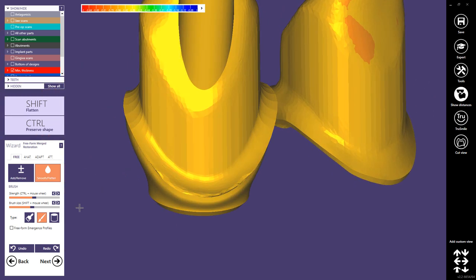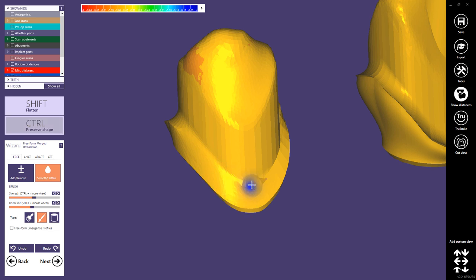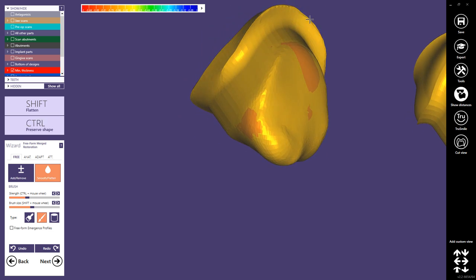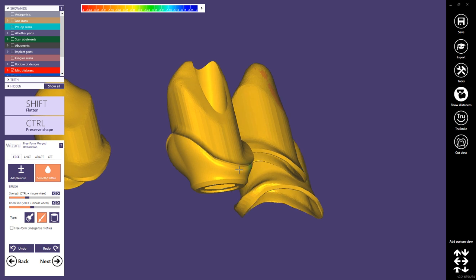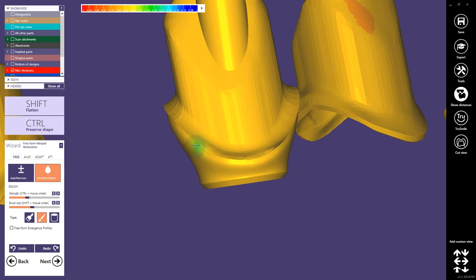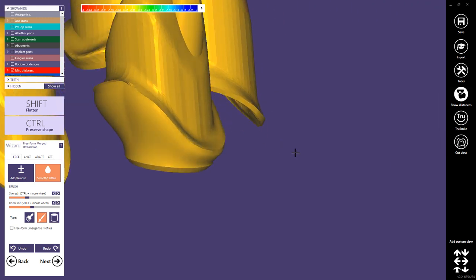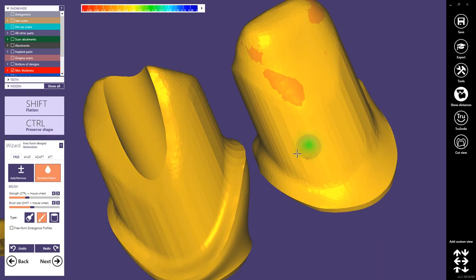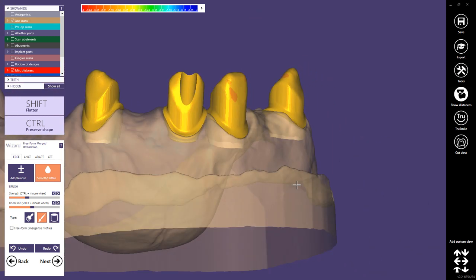This one looks good — no need to do anything here. Decrease the strength a little bit. We can even remove this border completely here — I haven't seen this in this state before, but no problem, I can still remove it.